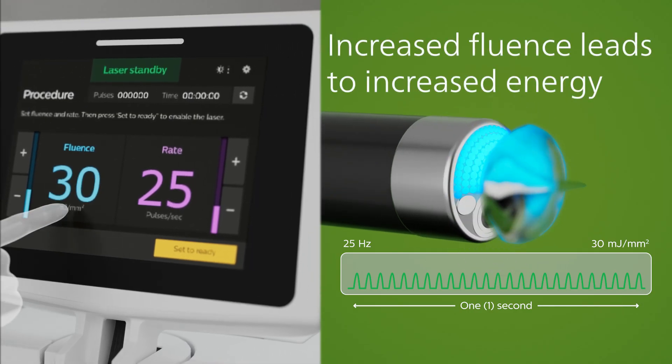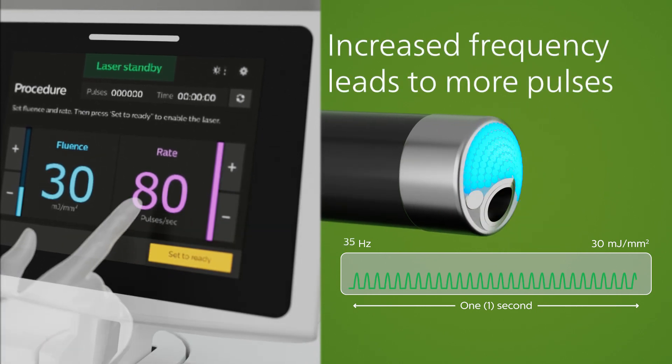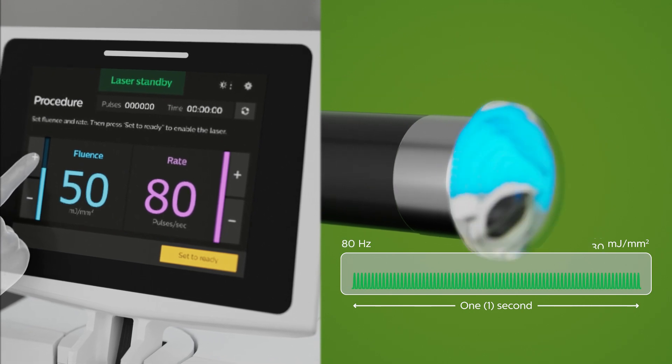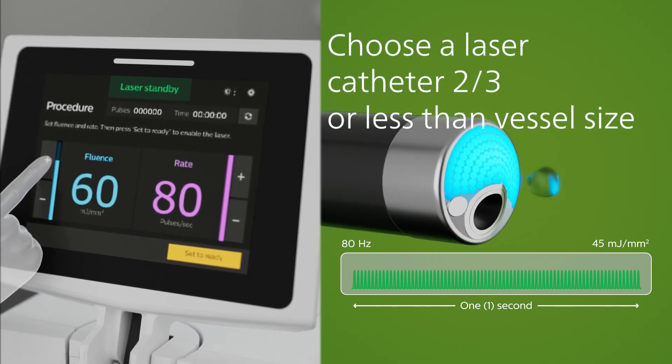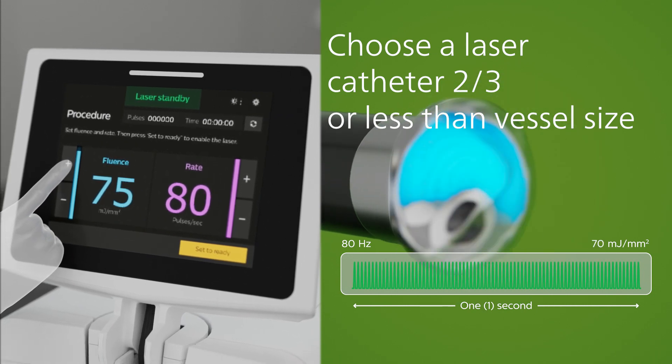Philips Laser Atherectomy has customizable energy density and frequency modes to effectively debulk different morphologies. Fluence is light energy density delivered by the laser to the lesion. Rate is the number of light pulses the laser will deliver per second.